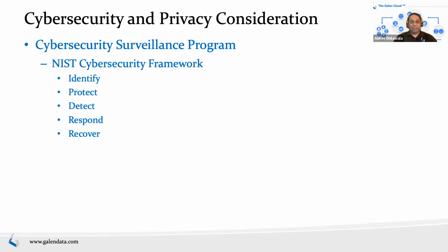We've had cases where people were doing backups, or thinking they were doing backups of data, and the backup process stopped or failed, and nobody knew. And when they actually needed it, there were no backups, and so they lost a chunk of data, and it becomes a business risk, not only a patient or regulatory risk. So things like that. Make sure that when you set this up, you are testing. Just like anything else, you have to do trial runs. It's like a fire test. You do fire alarms every year or every 6 months. Same thing. You want to do this respond and recover process as much as needed.